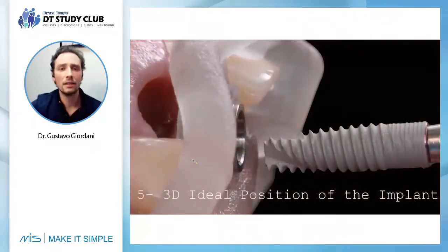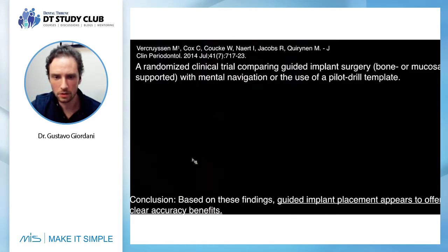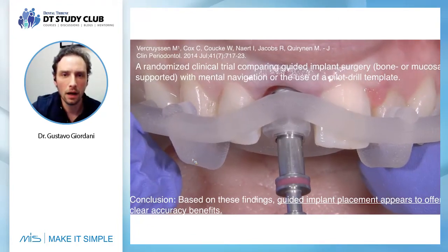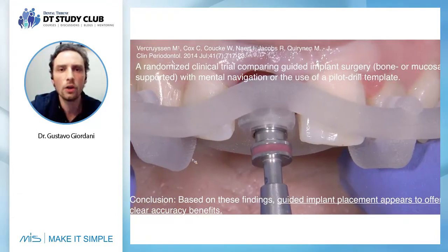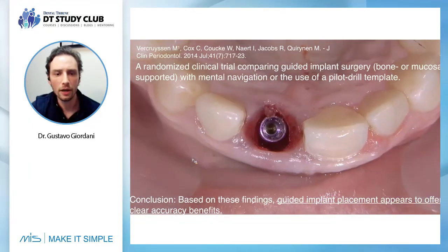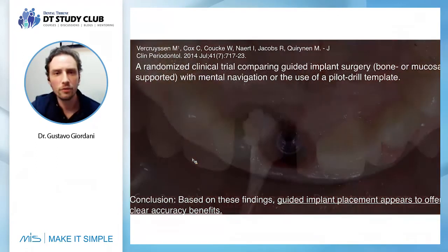So by using this guide, we drill the implant in the correct position and also you place the implant with the guide, because it's not correct to drill the implant position and then remove the guide to place the implant with the free hand. No. You have a system that allows you to place the implant also guided in a very safe way, in a very good way, and we finish the implant position for Monica's case by using a V3, 3.9 by 13. Very good, very safe with the guided surgery.